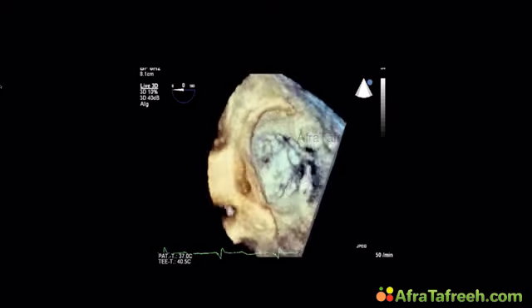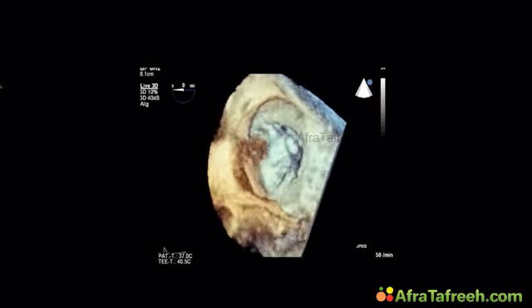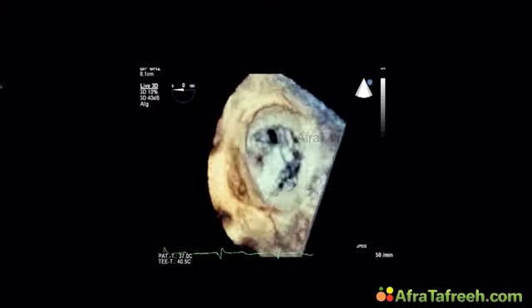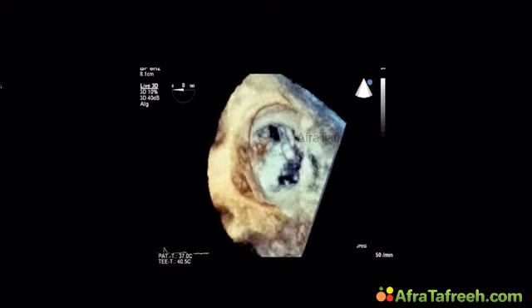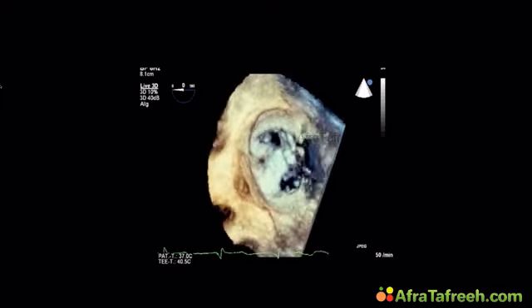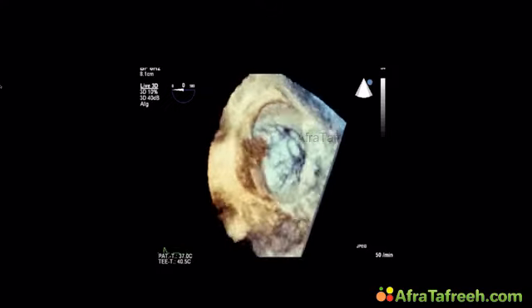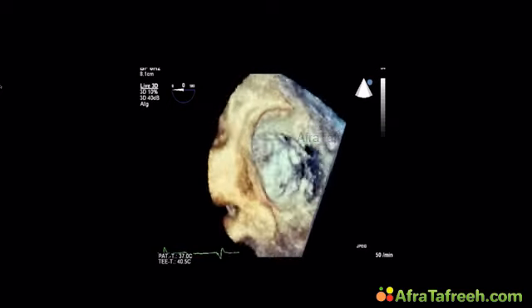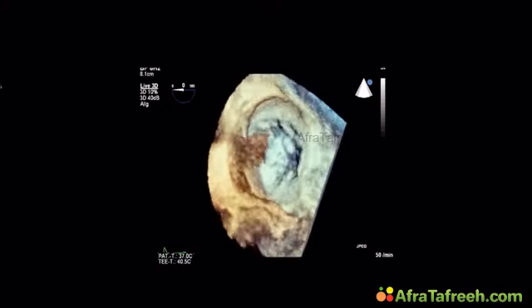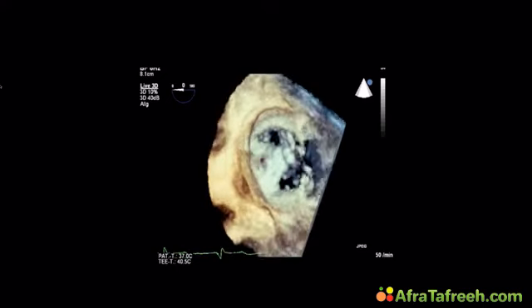severity of mitral regurgitation, because there will be flail leaflets where you don't have very much regurgitation. And the second issue is if the patient is well adapted to volume overload and he's asymptomatic and the ventricle is doing fine, you can still perform what we call watchful waiting. In other words, we just follow the patient up, and once he gets symptomatic and once the ventricle shows signs of deterioration, operate on him then. There have been plenty of studies that have shown that this approach is pretty feasible. So a flail leaflet does not always mean that regurgitation is very severe.